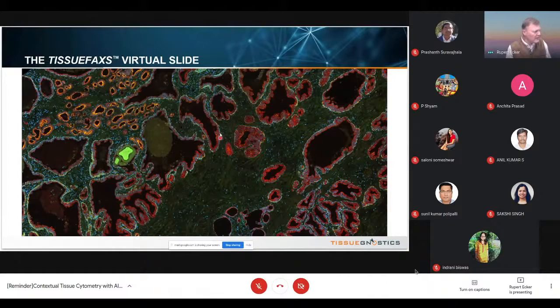These are the basal epithelial cells, and in orange is a kind of tumor marker which shows at an early stage malignant transformation. The absence of a basal cell layer and the presence of this marker on the secretory epithelial cells indicates on the functional level malignant transformation, and that this is actually a prostate cancer. Also morphologically, when we just look on H&E, we might not recognize this.